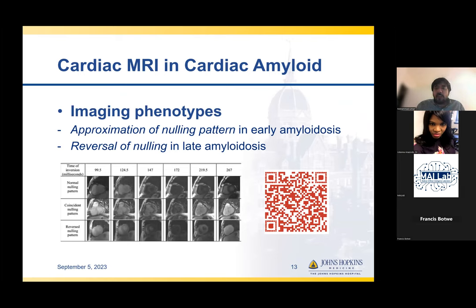The point for ECV is to find microscopic scar, scar which is not in macroscopic quantities yet. And that's why ECV has more sensitivity. When the scar develops into the myocardium, within the interstitium in between the myofibrils, it has to be enough scar to be seen as delayed gadolinium enhancement.